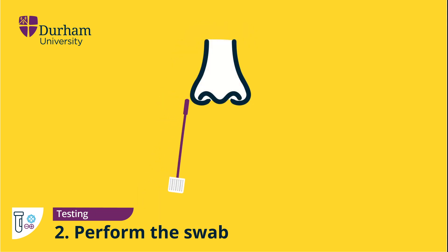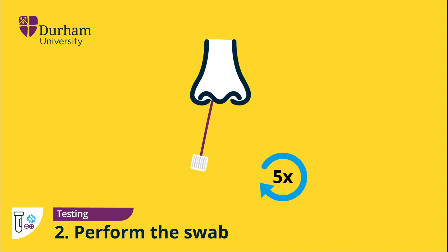Using the same swab, gently insert the fabric end into a nostril until you feel a slight resistance. This should be about 2.5 centimetres, or one inch, up your nose. Rotate the swab five times, then slowly remove it. Using the same swab, repeat the process for the other nostril.